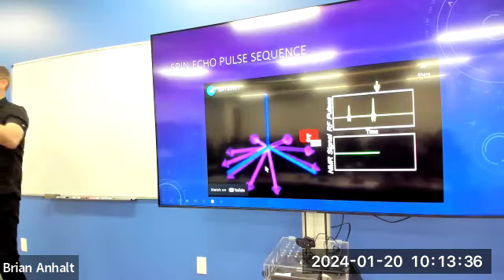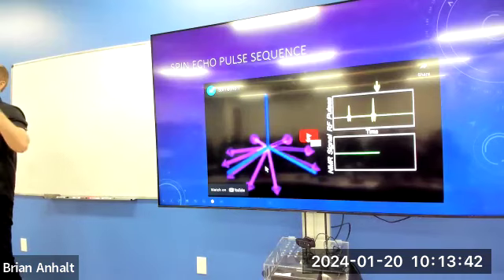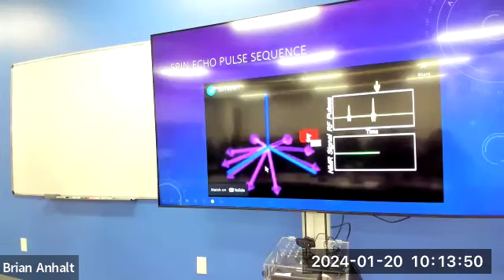To have phase coherence, thus transverse magnetization, we have to have all the protons in phase and continue to persist in phase, right? But what if the magnetic field strength isn't even? Are they going to persist at the same frequency? They're not, right? The Larmor equation says B0 times the gyromagnetic ratio.